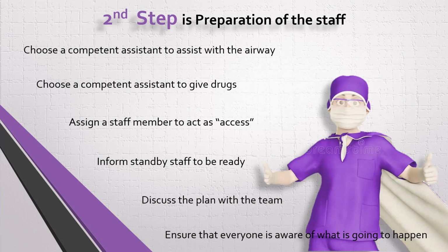Plan B with fast track. Plan C is a second generation laryngeal mask or iGel fast track. You have to be specific. Plan D will be needle cricothyroidotomy or scalpel cricothyroidotomy. You have to be specific. Everyone in the team should know his role.